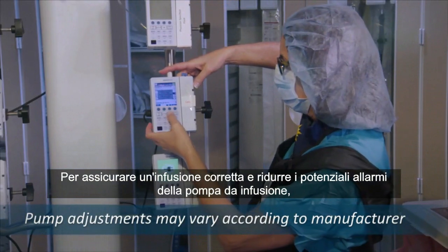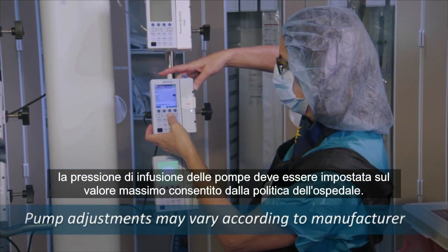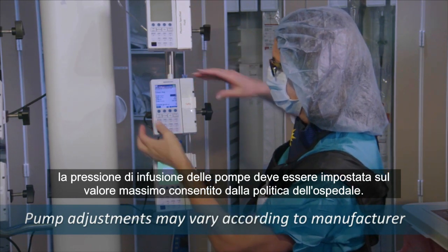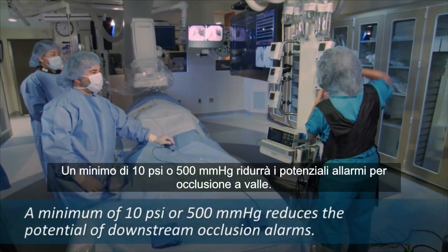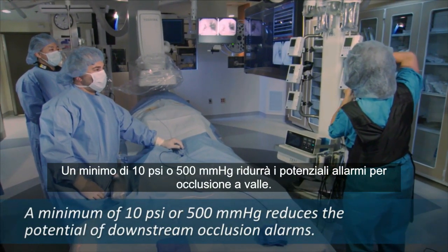Insert infusion tubing into the pump, start the pump, and turn the stopcock on to the catheter. To ensure proper infusion and reduce the potential for infusion pump alarms, the infusion pressure setting on the pump should be set to the highest value allowed by hospital policy. A minimum of 10 psi or 500 millimeters of mercury will reduce the potential of downstream occlusion alarm.